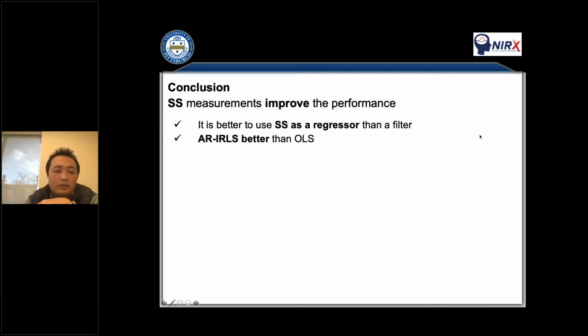And then autoregressive is better than OLS: first, higher AUC, which means better performance, and also better control of type 1 error. It means the false positive rate is good and not overestimated.